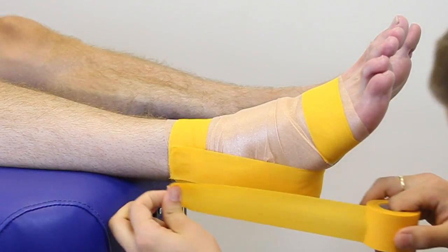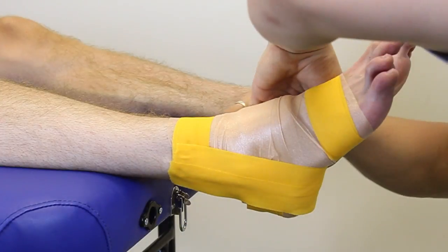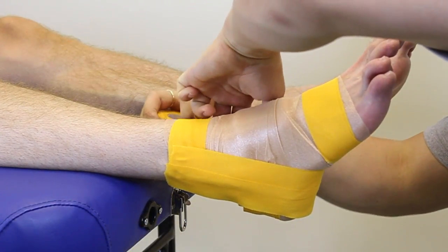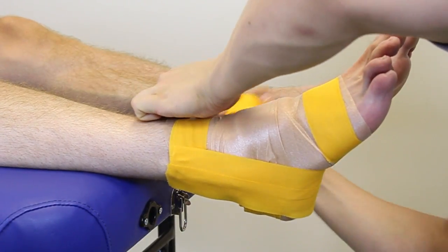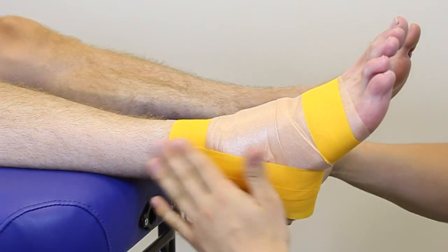We're going to apply a third stirrup exactly the same way as the first two, and then a fourth, making sure we're not on the same line again. That's going to add to the strength.